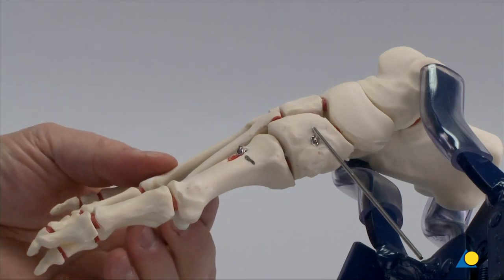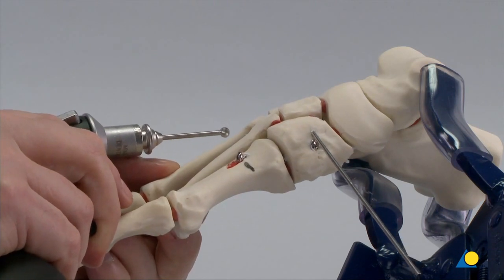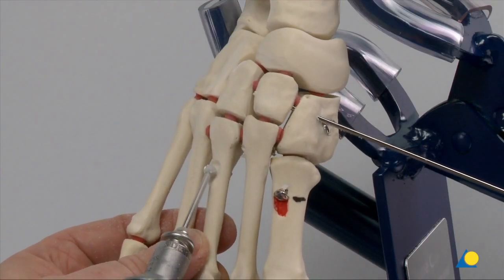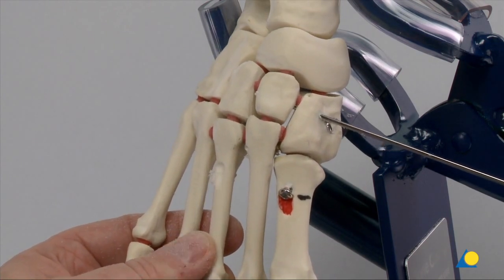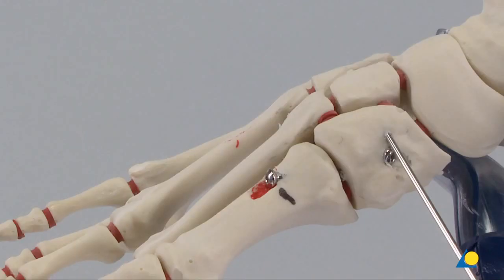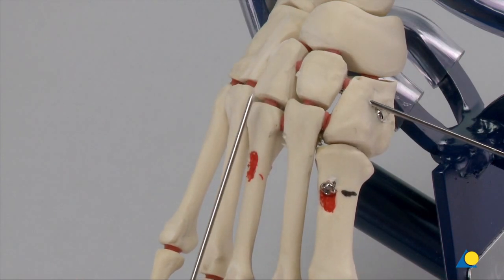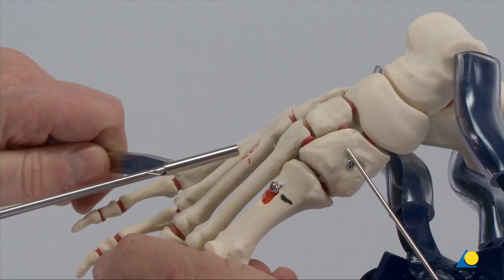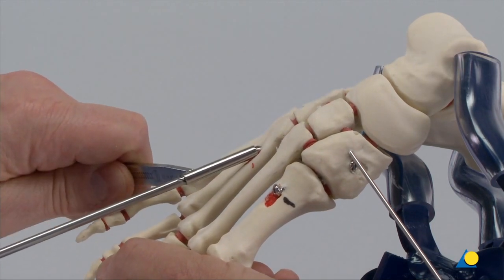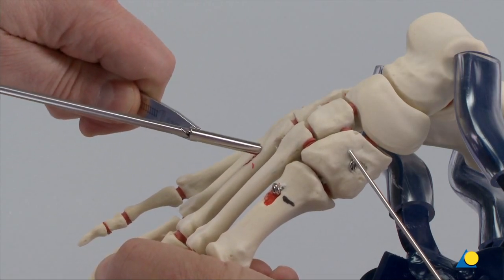The next step is to address the reduction of the third TMT joint. The previously described technique is repeated. A pocket hole for the screw head is made with the burr and marked in red. In the clinical setting, there may be indications where a smaller diameter screw is advisable for the third MT. The screw can be aimed for the lateral cuneiform. The assistant provides stabilisation distally. The trajectory is very flat, as a more vertical trajectory would miss the bottom of the cuneiform.